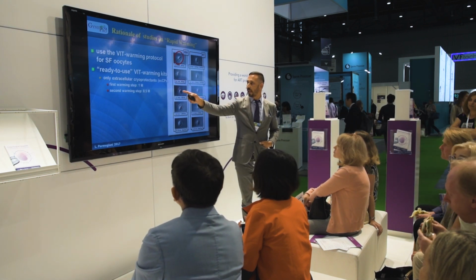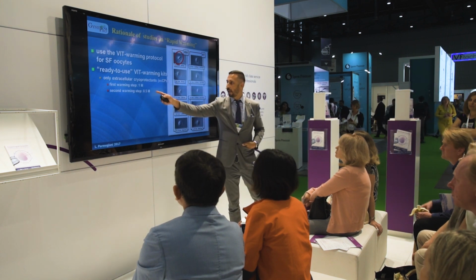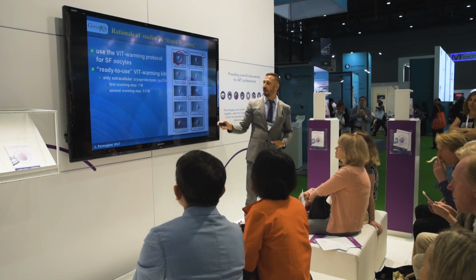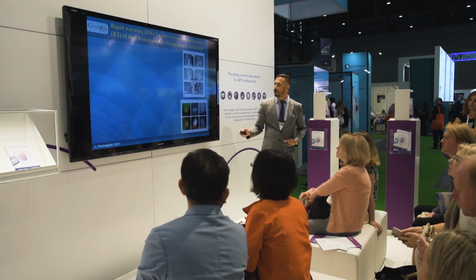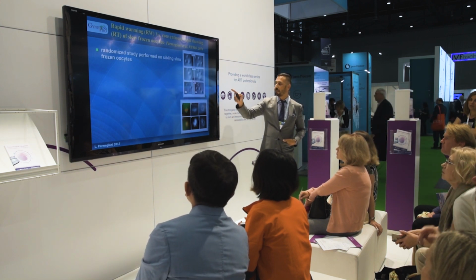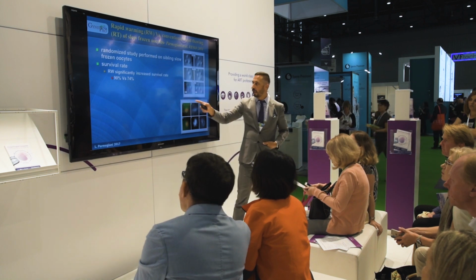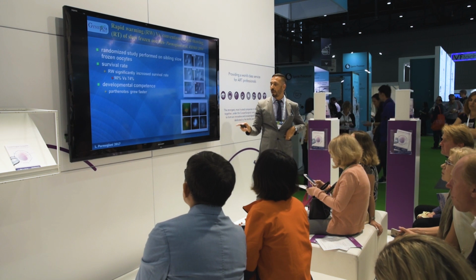To do this, we used ready-to-use warming kits, with the first warming step with 1 molar of extracellular cryoprotectant, and the second warming step with 0.5 molar of extracellular cryoprotectant. This is what we observed. We performed a randomized study on sibling slow frozen oocytes that were donated for research, and we observed a significant increase in survival rate when performing the rapid warming of these slow frozen oocytes.